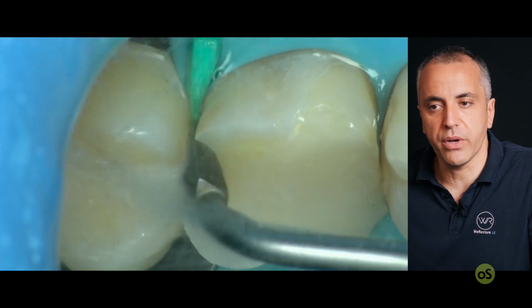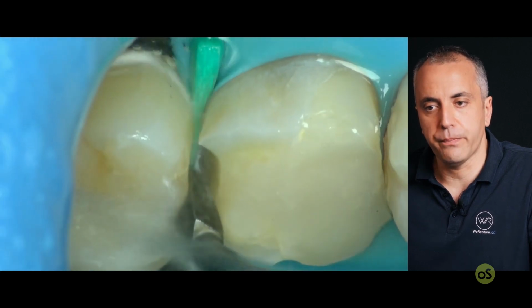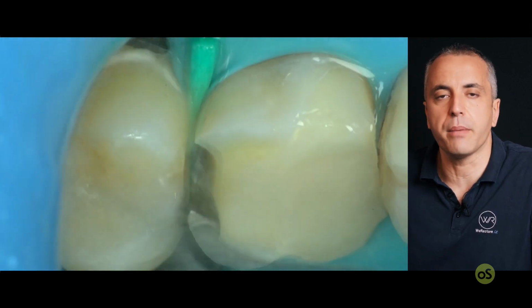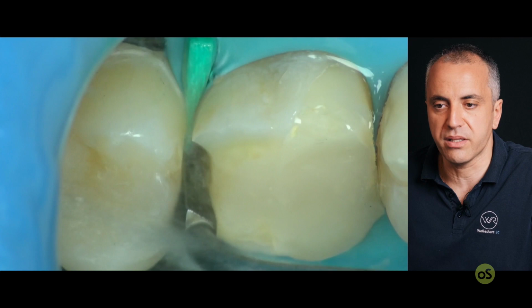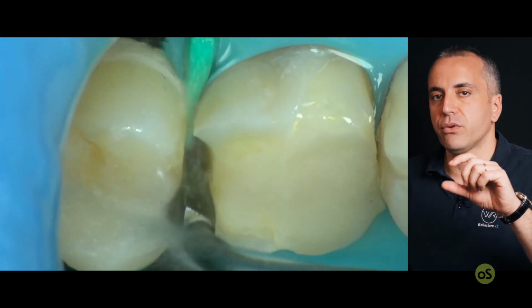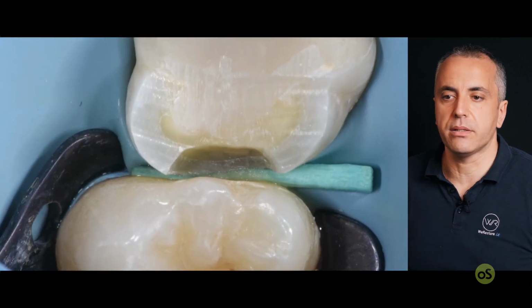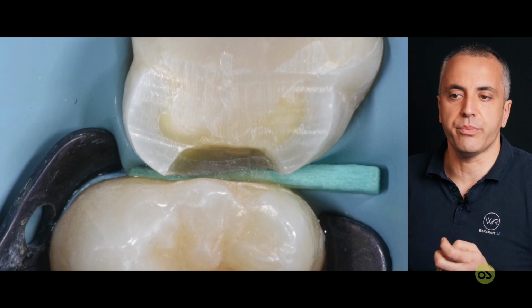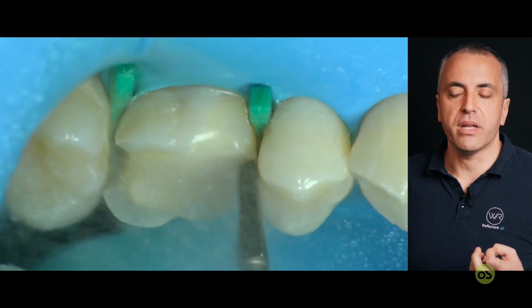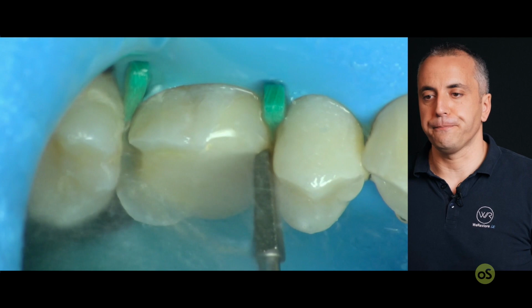Look at the wedge. The wedge is a trick. The wedge is needed to protect the rubber dam. The wedge is a sacrifice wedge. You can prepare it. We generally prepare with a burr, with a sonic instrument, because if we do this, we always have the correct amount of space between the cervical margin and the papilla, let's say. You see, the wedge is prepared, and then you can also produce a customized wedge. That's why me and Salvatore like to work with wooden wedges very much, because you can customize them.